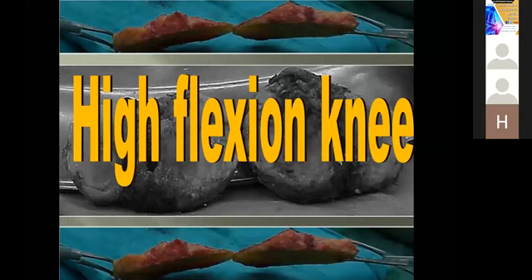When I went on my fellowship in Germany in 2008, I asked them about high flexion knee. And they said, oh, Dubai's knee. You mean the total knee that's propagated in Dubai? They are criticizing the high campaign made behind this design, providing it as a solution for each patient who wants to sit on the ground, to pray every day on the ground, because they said it's not designed for that.